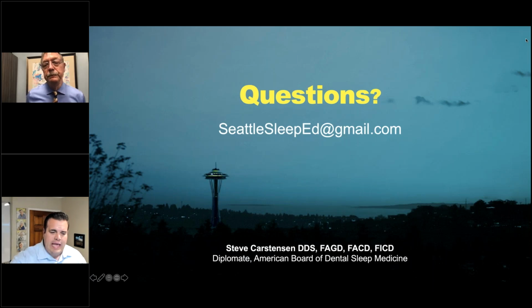Okay, great. And then the next question was about the mouth shields. So you ran through that really quick. I know you can use them with more than just the MyTap. Could you give us that list of appliances that you can use them with? Sure, the DreamTap and the TAP3, the full-on custom devices that are available from Airway Technologies, Airway Labs, and their lab partners as well.